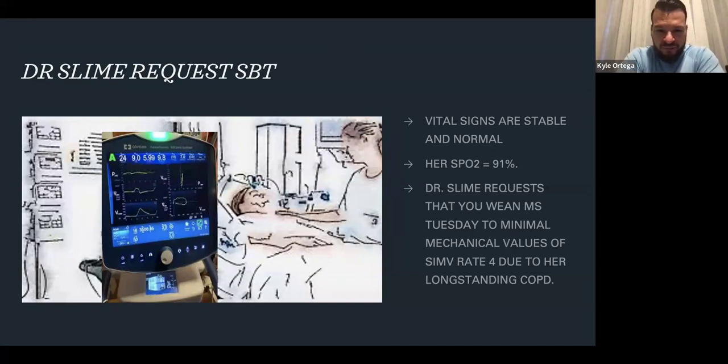And then same thing for NIF. I want to watch her chest rise, look at her waveforms, and wait for her to be ready to take that inspiratory breath. I would hit the button, special procedures or special maneuvers on the vent. Got the NIF button, and then tell her, all right, I need you to take a big, big, deep breath, as big as you can. Hold the button, and it'll record our NIF. Hopefully it reads over 20, or -20.